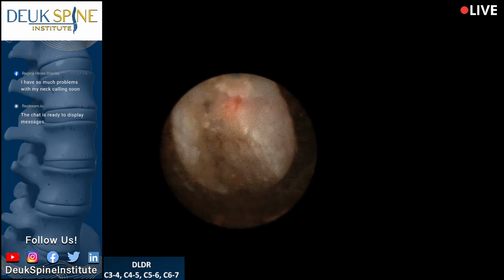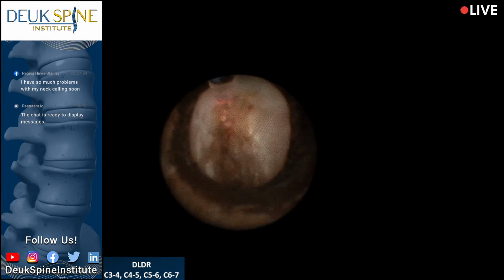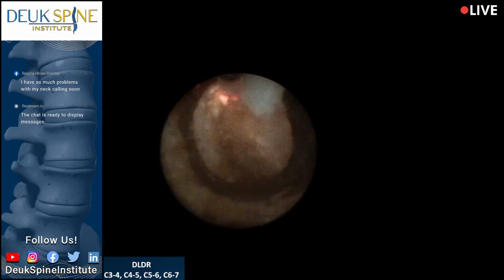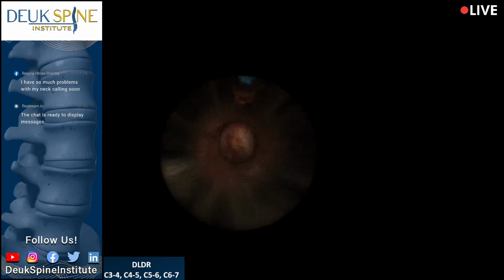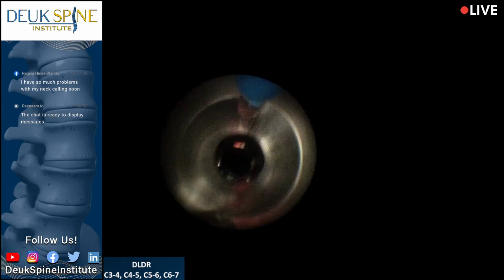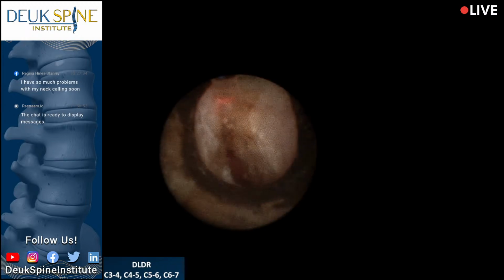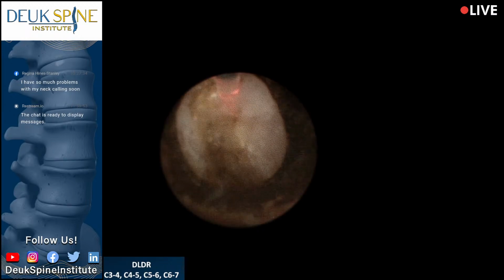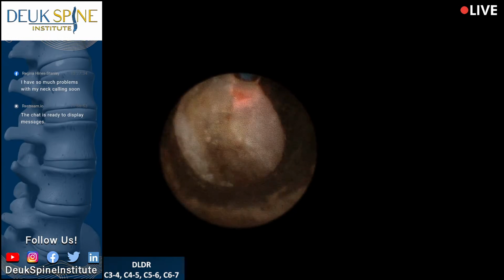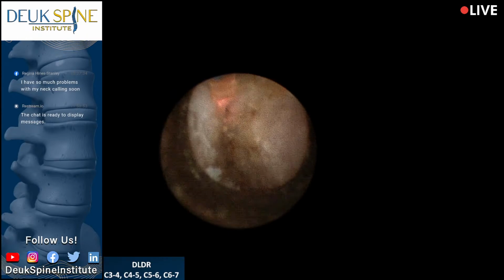They've been around a long time. All this is scar tissue over here. I was working on that while you guys were watching the video. All scar. Look at that. There's a piece of herniation right there. Okay, so that's going to float out. And then I've already worked on his left foramen. And now I'm working on the right foramen. He's got narrowing on both sides, foraminal stenosis. But it was really bad on the other side.